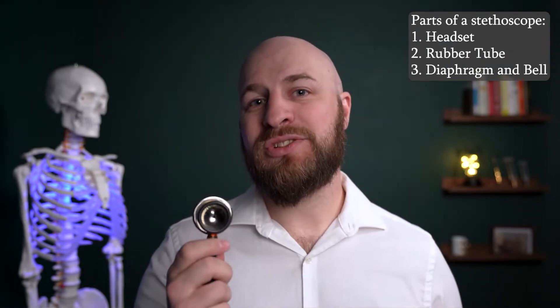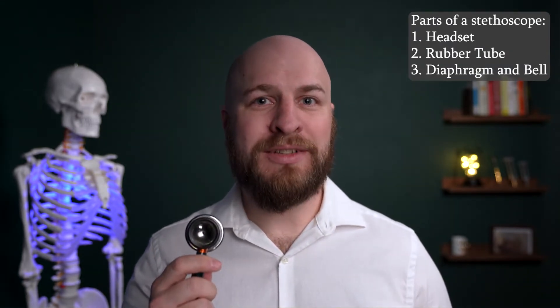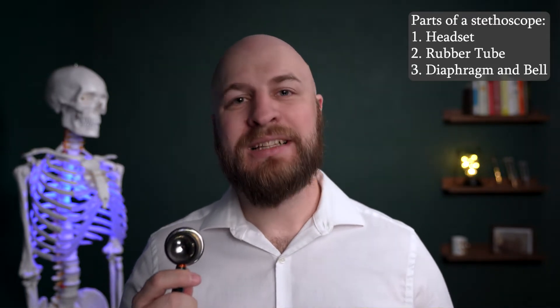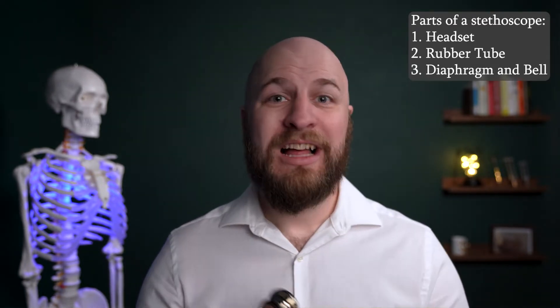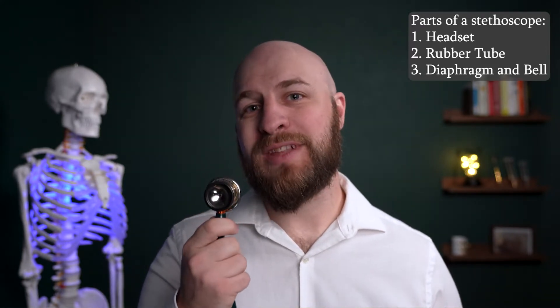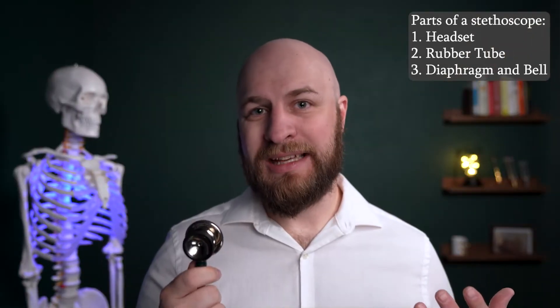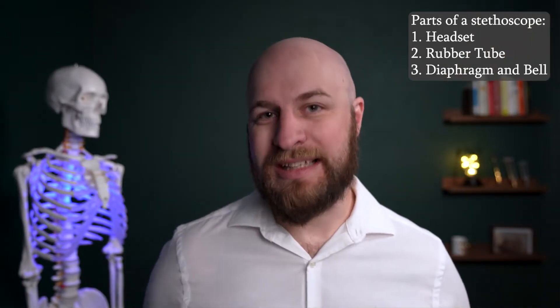The bell is used for listening to low-frequency sounds. Low-frequency sounds are often associated with pathologies such as heart murmurs or mitral valve stenosis. Finally, both the bell and the diaphragm can be custom engraved with your name or something else so that you can identify your stethoscope if you lose it.